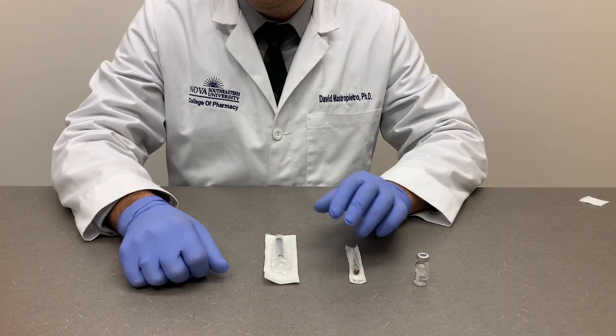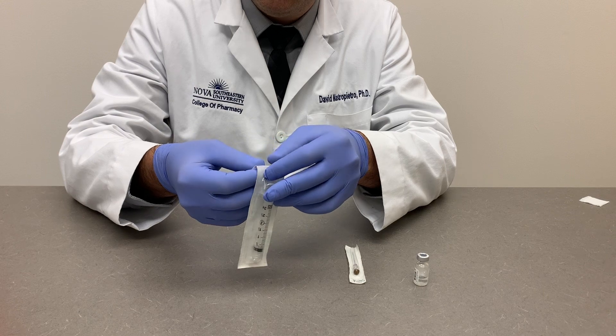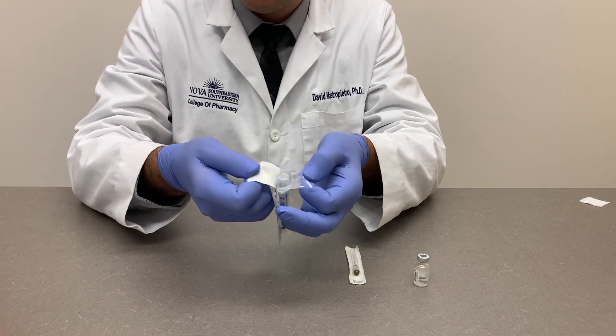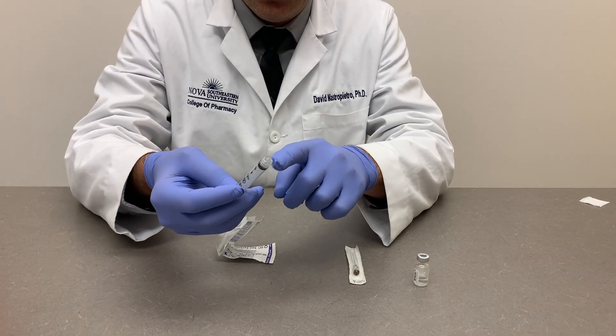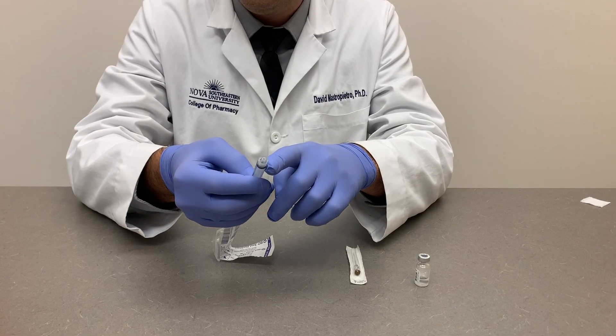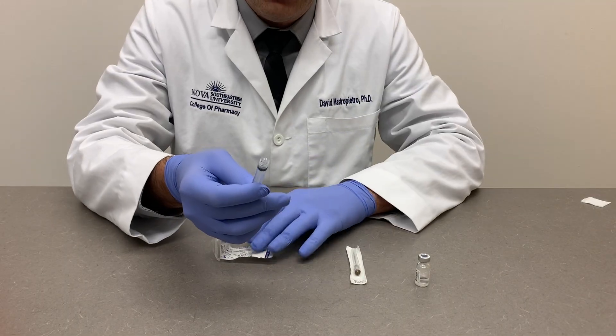The next step is to prepare the needle and syringe. Carefully remove the syringe from the packaging by peeling it open from the end specified by the manufacturer. Make sure the tip of the syringe, which is the critical point, is not touched to any surface — that means your fingers or the table. This point should not be touching them.